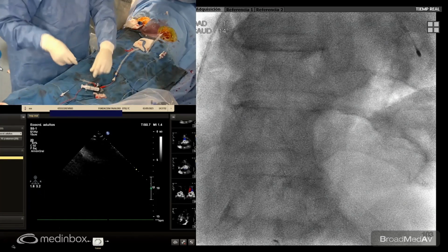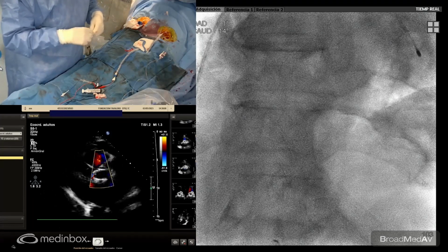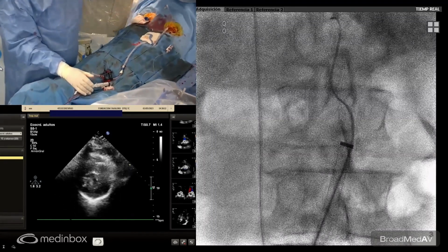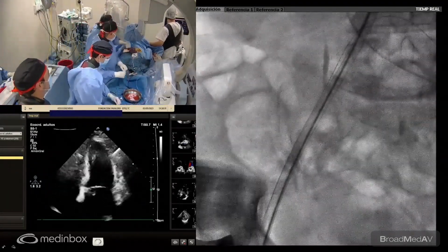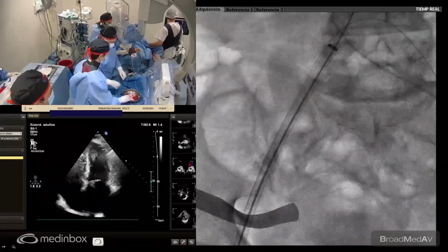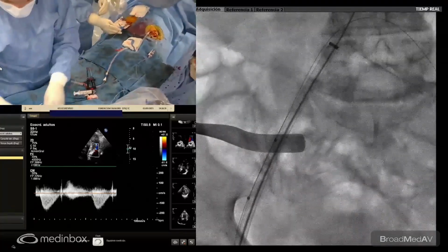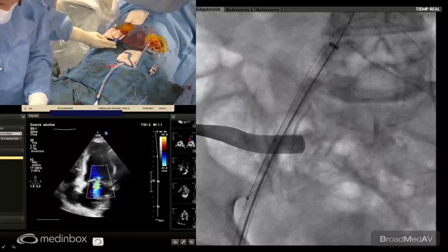I think we have done something different, protecting the ostium. In case the left main were compromised, the idea is to leave the guide extension inside the LAD to advance a protected stent into the left main. And to position the stent, and when we are sure the position is okay, then we can pull the guiding, or excuse me, the guide extension and deploy the stent. And we can advance the guide extension again over the balloon of the stent, so that we can post-dilate to put the distal stent in case of a dissection or anything goes wrong.